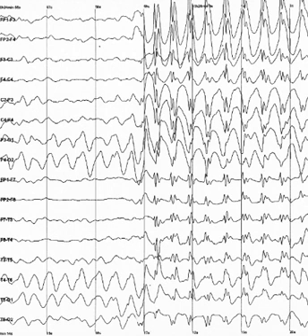EEG vs MEG. EEG reflects correlated synaptic activity caused by postsynaptic potentials of cortical neurons. The ionic currents involved in the generation of fast action potentials may not contribute greatly to the average field potentials representing the EEG. More specifically, the scalp electrical potentials that produce EEG are generally thought to be caused by the extracellular ionic currents caused by dendritic electrical activity, whereas the fields producing magnetoencephalographic signals are associated with intracellular ionic currents. EEG can be recorded at the same time as MEG so that data from these complementary high time resolution techniques can be combined. Studies on numerical modeling of EEG and MEG have also been done.